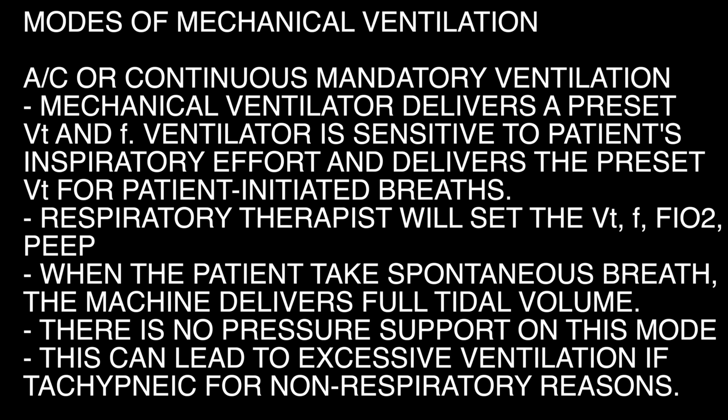The respiratory therapist will set the VT, F, FiO2, and PEEP. When the patient takes a spontaneous breath, the machine delivers full tidal volume. There is no pressure support in this mode. This can lead to excessive ventilation if the patient is tachypneic for non-respiratory reasons.